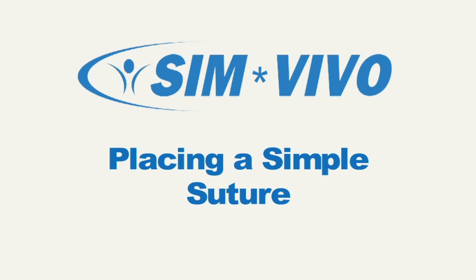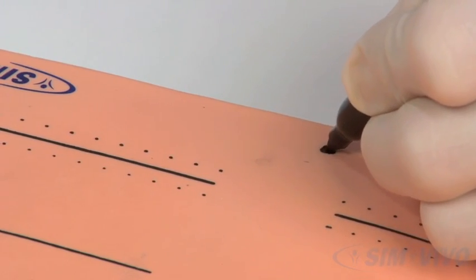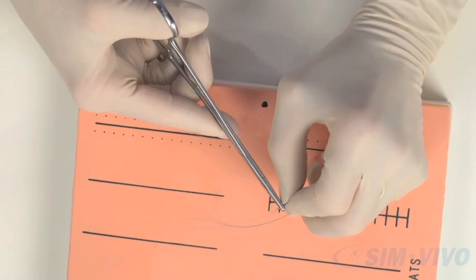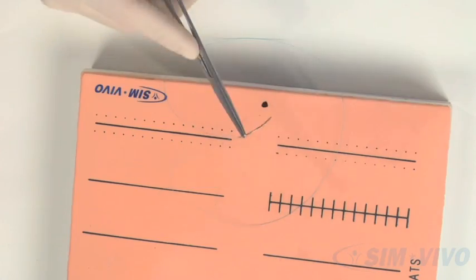Initially, we are going to practice the simple hand motion for placing a suture. On your suture board, place a dot at a point halfway along the bottom, about 1 inch in from the edge. Load a 30mm needle on the end of your needle holder. Make sure that it is perpendicular and grasp it at a point about 2/3 to 3/4 around the curve.